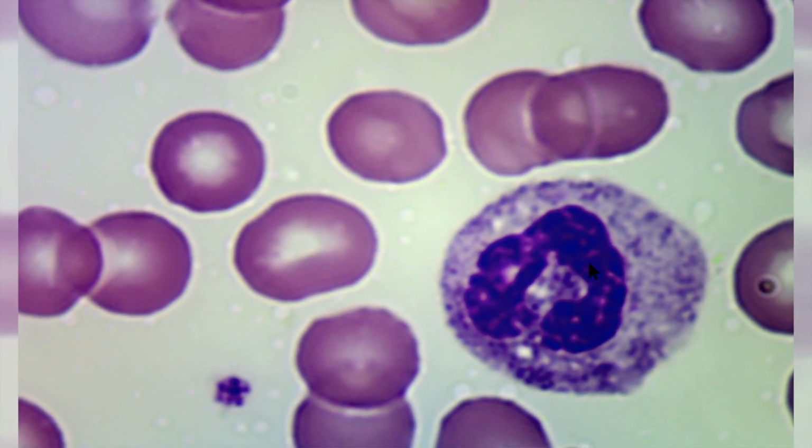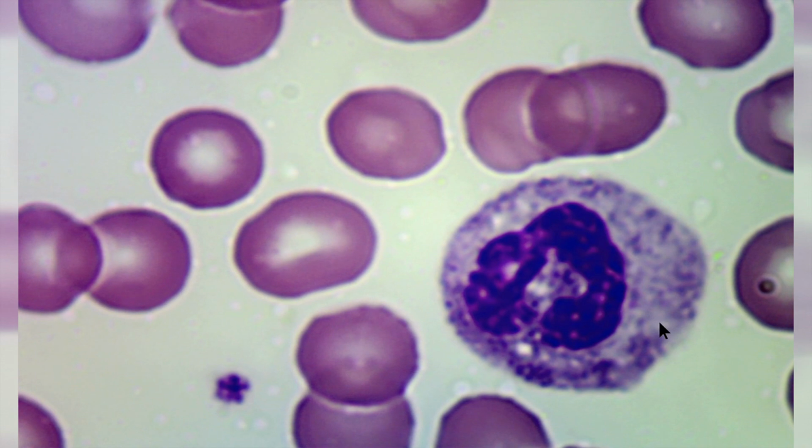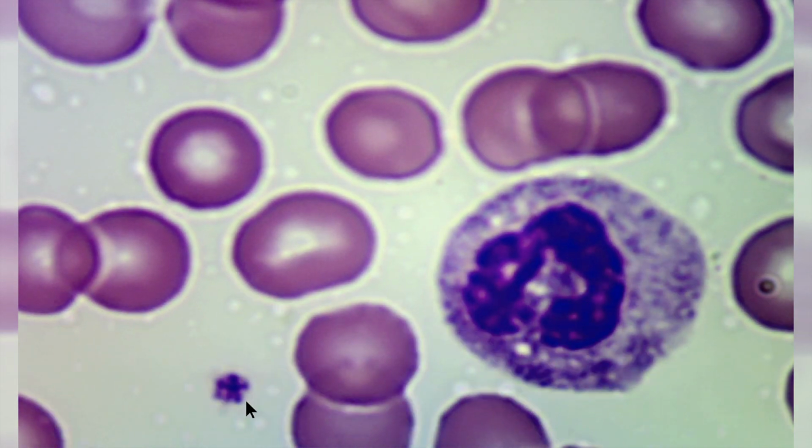Here we have a band neutrophil. Now you can see the cytoplasm of the neutrophil is quite different from monocytes and different from the eosinophils. The nucleus is continuous without any specific segmentation, and that indicates this is a band, a slightly immature neutrophil. The cytoplasm has various types of granules, of different sizes, but much smaller than what you observed in eosinophils. There is a platelet on this side, and it appears to be a normal looking platelet.